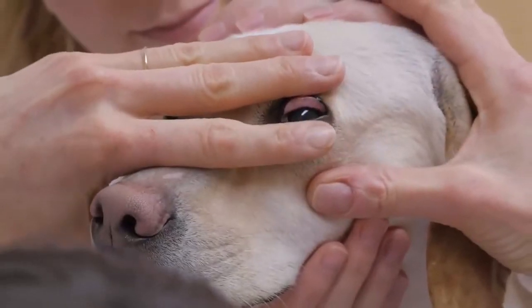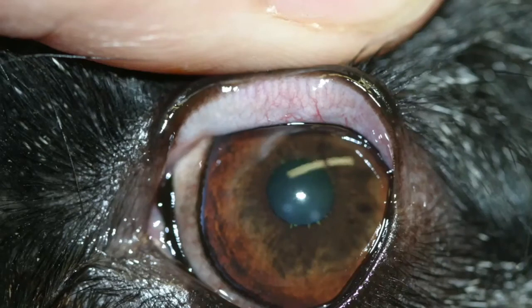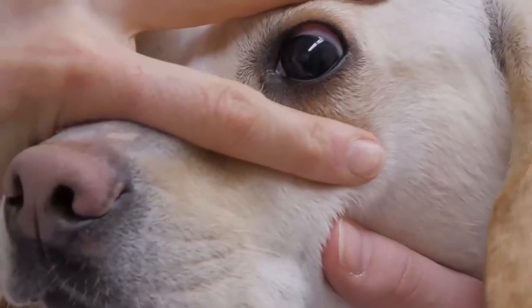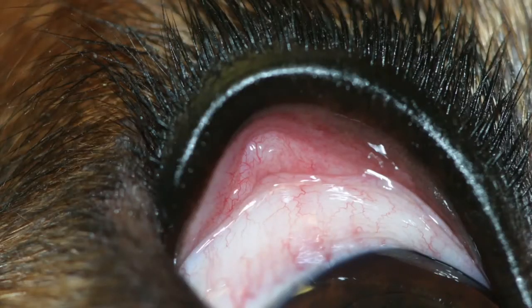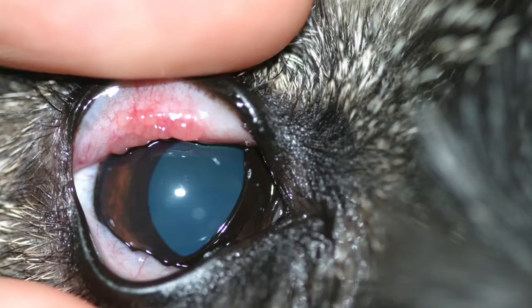Conjunctiva. Gently evert the eyelids and examine the conjunctival lining of the eyelids, the palpebral conjunctiva. This includes evaluation of the meibomian glands themselves. Loupe magnification is helpful for examination of the meibomian glands and to evaluate for ectopic cilia, which may be seen in the region of these glands. Retract the lids and examine the conjunctiva lining the anterior globe, the bulbar conjunctiva. Abnormalities such as chemosis, hyperemia, thickening, follicles, or masses should be recorded.